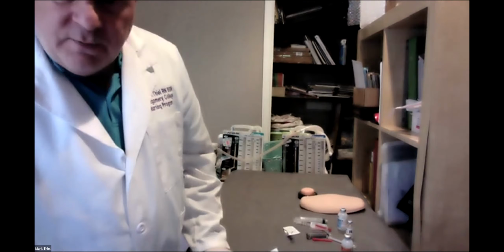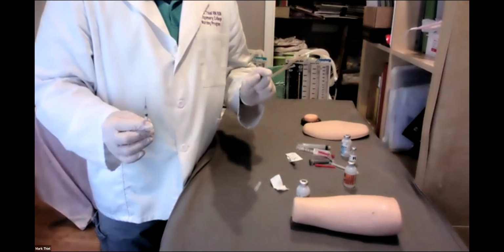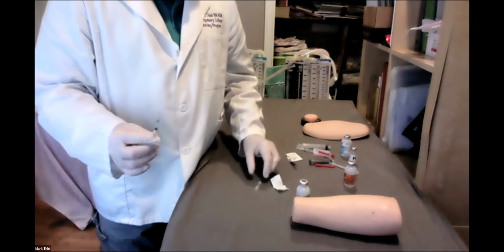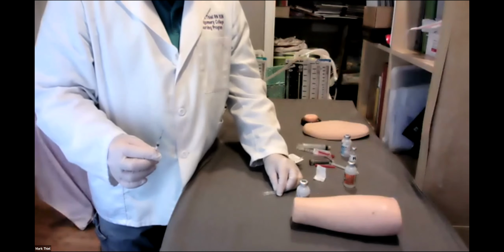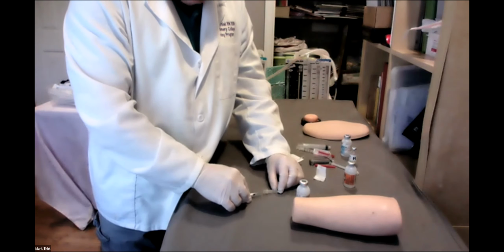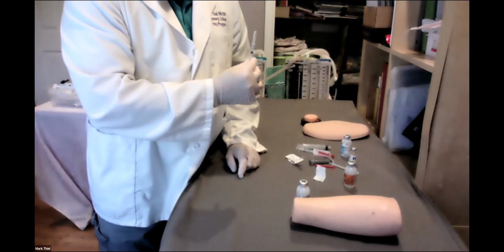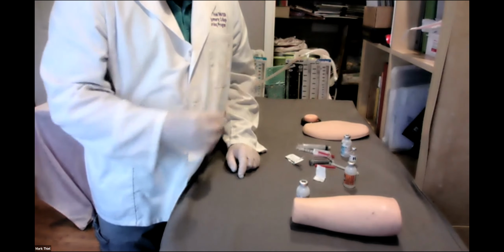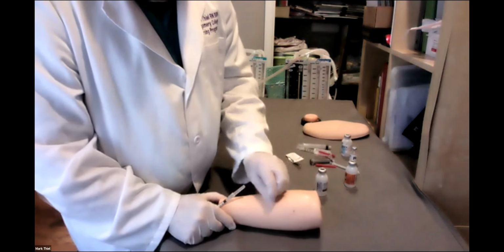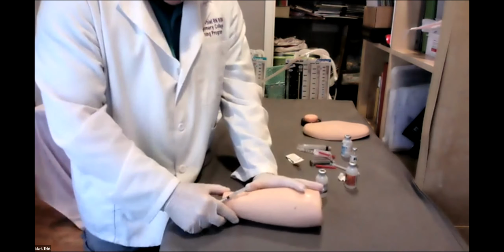When I'm preparing for my needle, you go back into the room, or in most cases, a doctor's office or an industrial, hospital included, clinic, industrial nurse that you're going to be working with in the office. Prepare. If you have to, what do we do? Walk to the patient. Right? Our prep: rub the skin in a circular motion down to 30. You know what I mean, 30. Right?